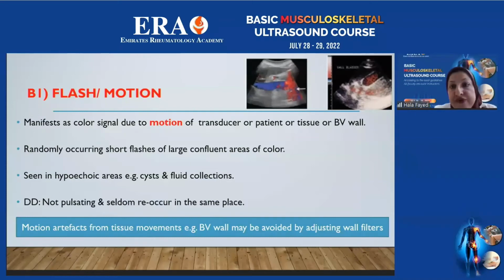For the second group of artifacts, we will mention the flash artifact or motion artifact.